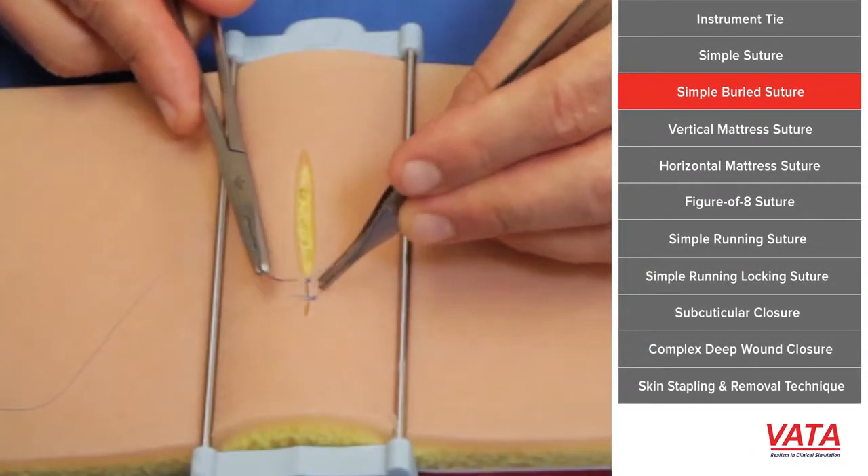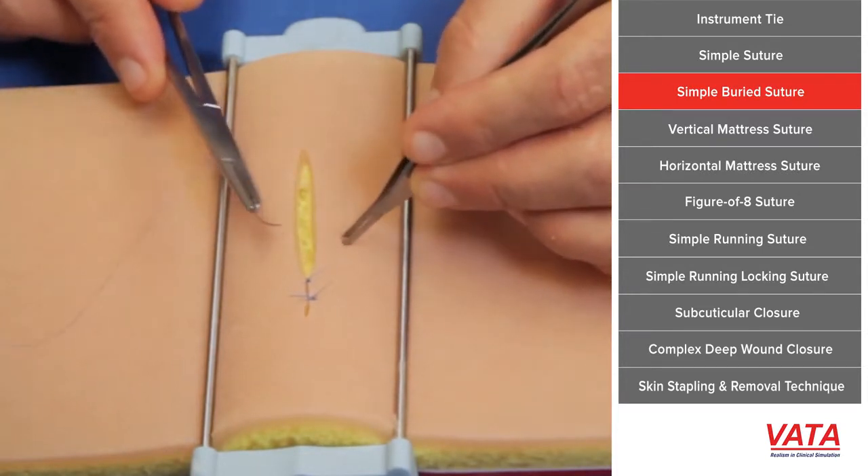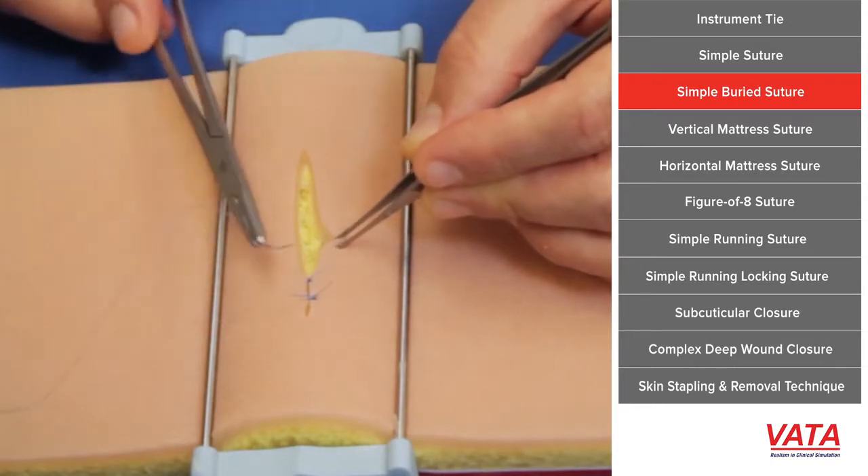Now I'm going to show you a simple buried suture. These are the sutures that we use when we're trying to re-approximate the skin, usually with absorbable suture, and then either gluing or steri-stripping where we're not doing a skin layer.